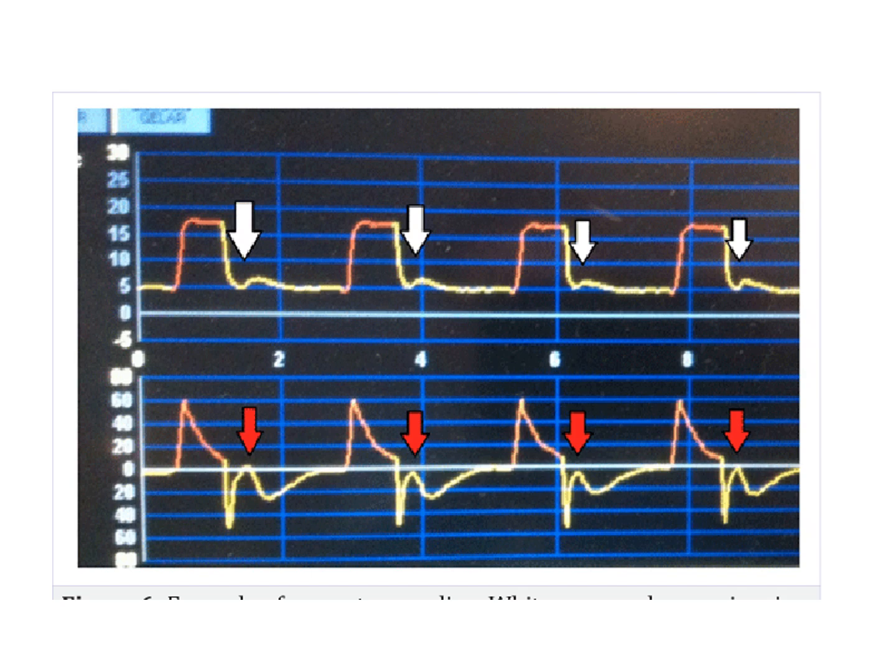It is very similar to deep tendon reflexes. If there is no control of the brain over the tendons, and you tap the tendon, it will contract. Very similarly, there is a deep sedation, no control of the brain over the diaphragm, and you tap the diaphragm by giving a tidal volume, it will contract. If it contracts very strongly to trigger a breath, it can lead to breath stacking. So that's called reverse asynchrony. But the setting in which you see reverse asynchrony, you always know that reverse asynchrony is going to happen in patients who are deeply sedated, not the patients who are not deeply sedated.